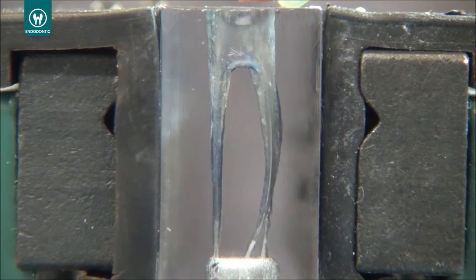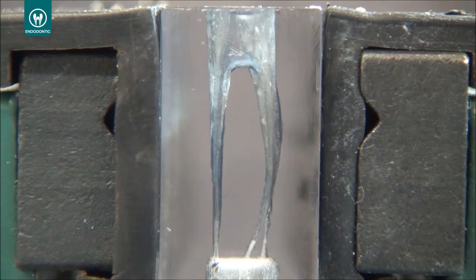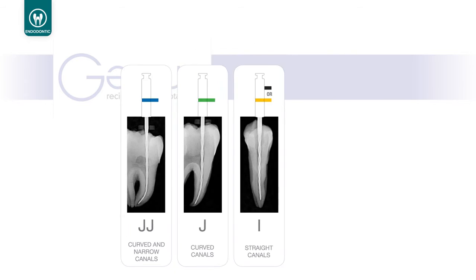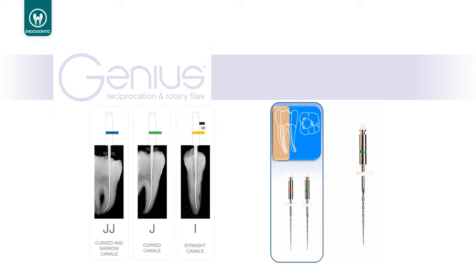After using the 25/04 in reciprocation, you have to do a lot of irrigation to remove as much debris as possible. And then you decide, based on anatomy, what will be the final file. In this particular example here, we will use the 35/04 because it's a curved canal, but it's not a narrow and curved canal. If you have a narrow and curved canal, you can go with a 30. In this case, it's just a curved canal, so it will be a 35.